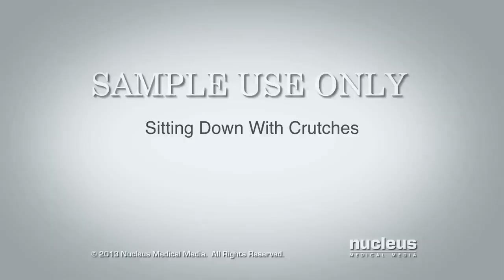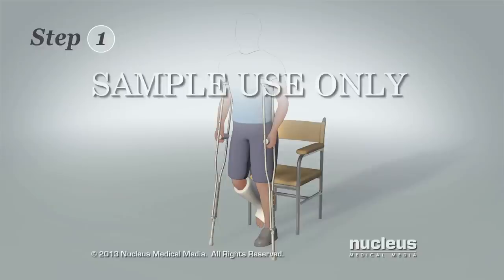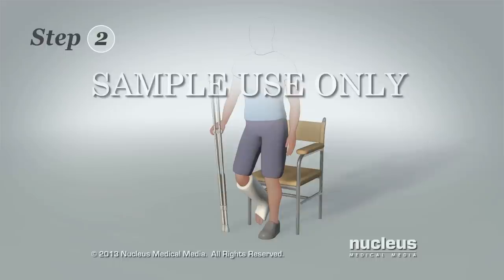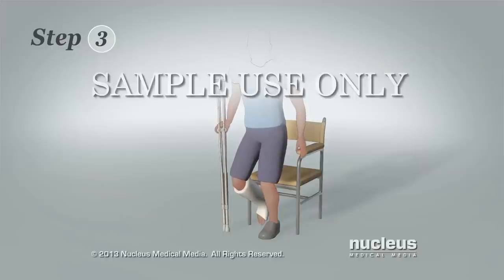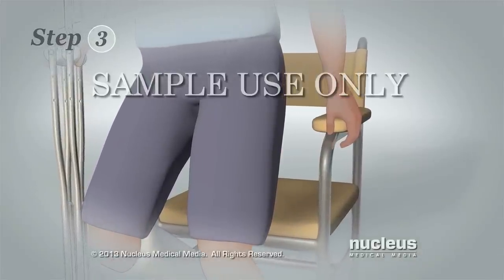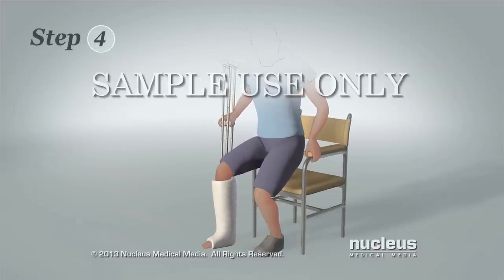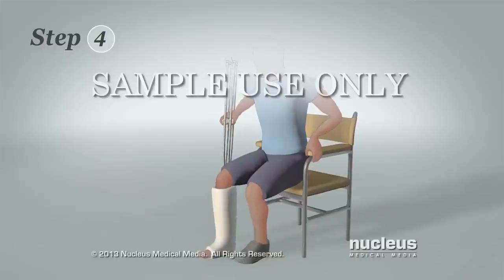You'll learn how to sit down with crutches. Step 1: Stand next to or in front of the chair. Step 2: Move both crutches from under your arms to your injured side and hold them by the hand grips with that hand. Step 3: Grab the chair's armrest or seat with your other arm. Step 4: Extend your injured leg in front of you and lower yourself into the seat.